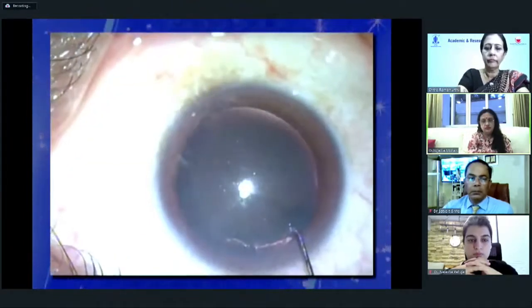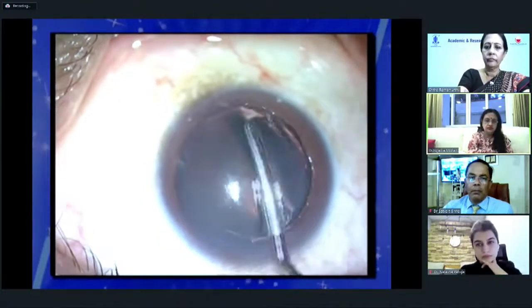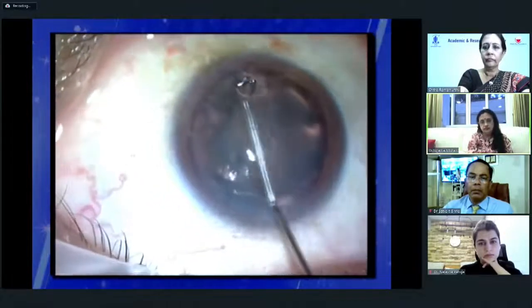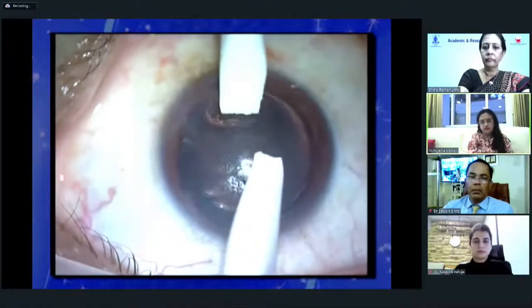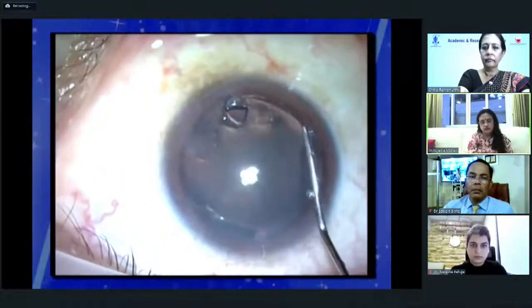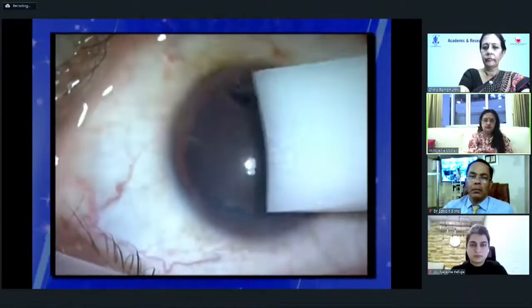In the first case, the pupil is dilated for a good transillumination effect on the striae. The flap margins are identified. The Sinskey hook is used to break the epithelium. The flap is lifted and floated on the bed. Two dry Merocel sponges are used to stretch the striae perpendicular to its direction. The stretching is done repeatedly till the visual axis is clear. Flap is replaced meticulously and a bandage contact lens is applied.